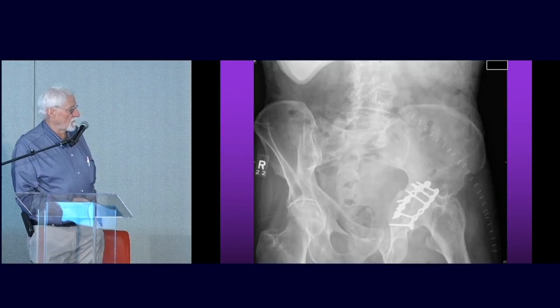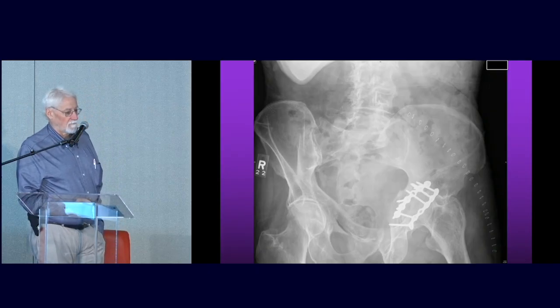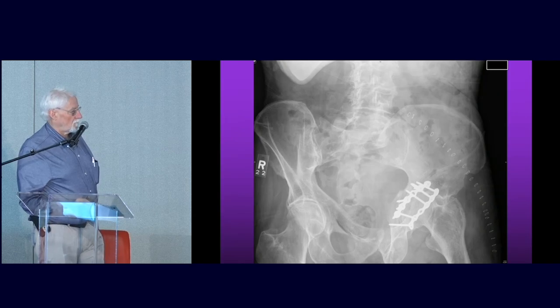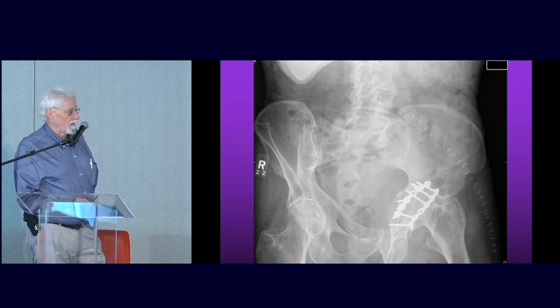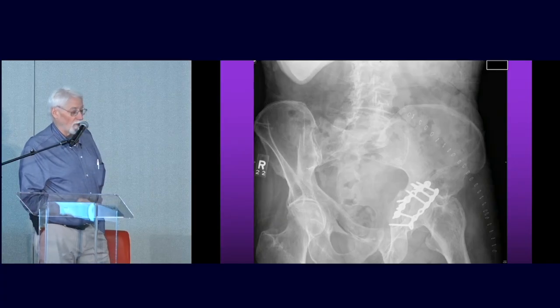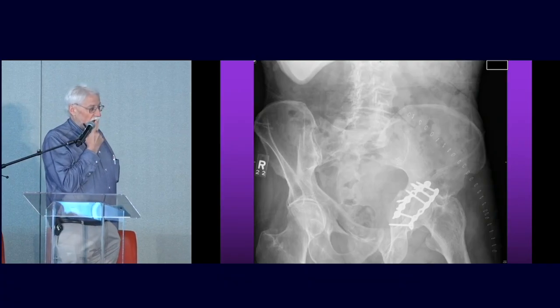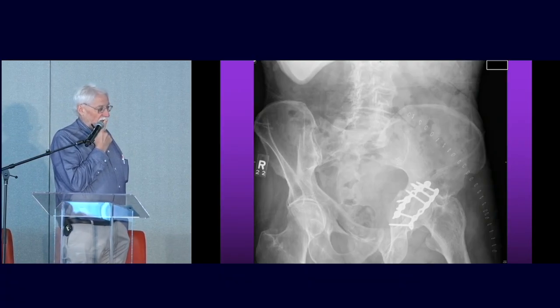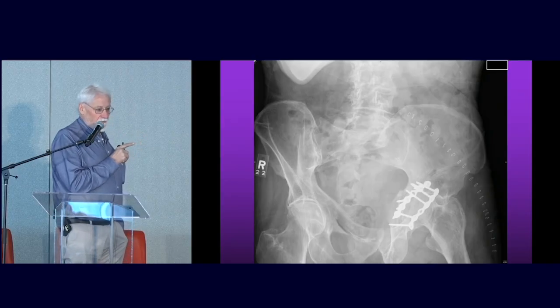So what would have been terrible about letting it heal like this? And maybe the reason I haven't had to go anteriorly to fix the anterior column is I would have let her heal like this. You didn't even give her a chance to heal like this. And she's still got the staples in. Yeah, no, as I said, it was within a week or so. And so if you say, what is the problem with waiting? I can't give you a great reason why, except I know that will start hurting her and being miserable.